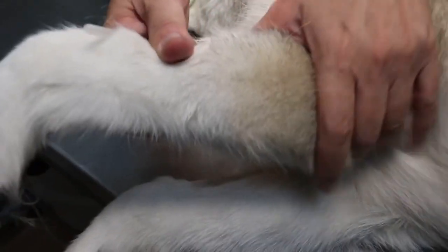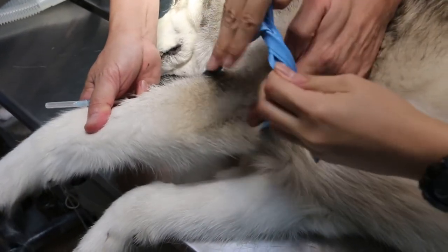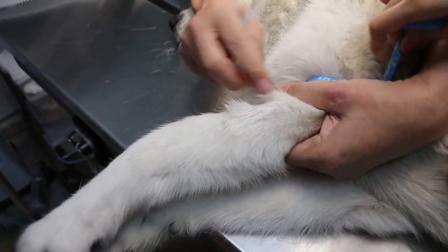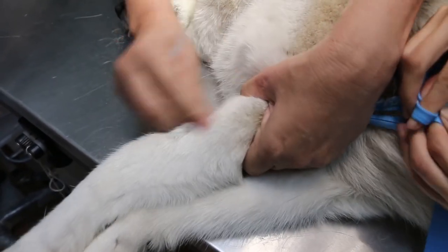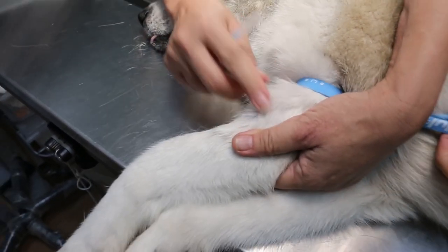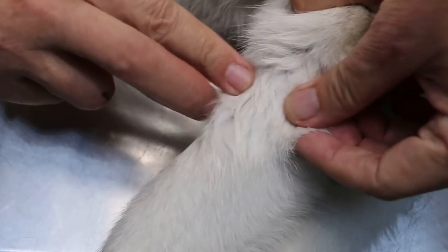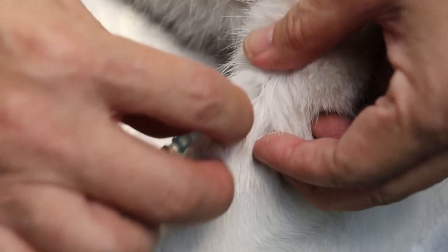Put the Tony K tourniquet round behind the elbow. Tighten it very tightly. Then apply alcohol — wet it. You can see here: part the hair and you can feel the vein there.